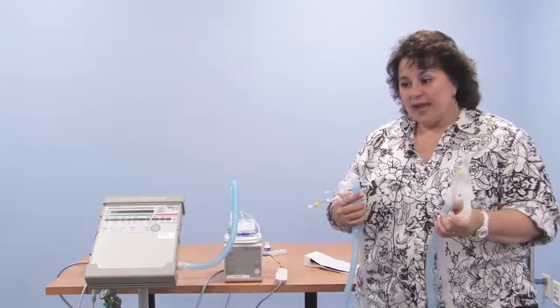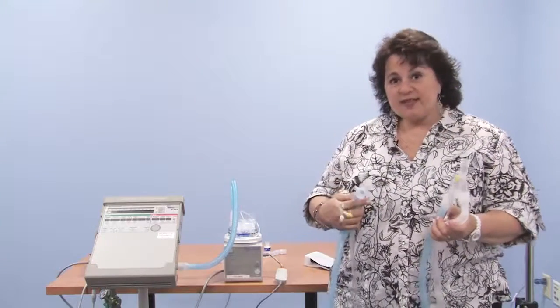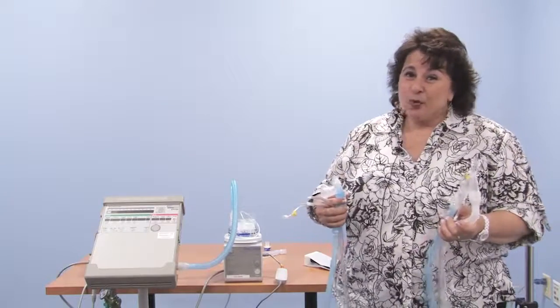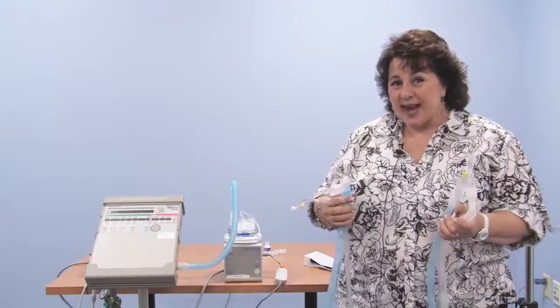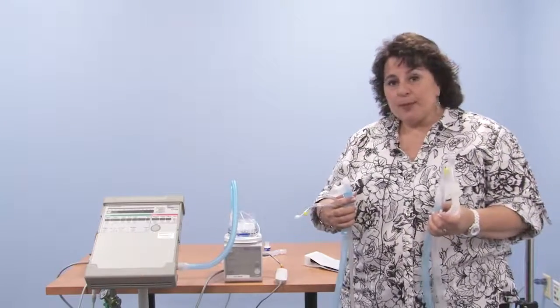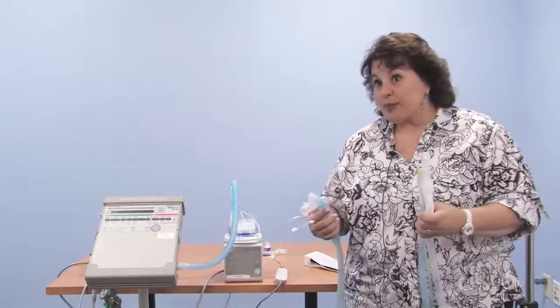So we want this air to go to the lungs at 98.6 degrees and fully saturated with water, and not rain out in the hoses. In a perfect world, that would be great, but we can't always have that. There are drafts. There are windows with sunshine coming in. So we try to protect the probes from cold breezes and warm breezes.